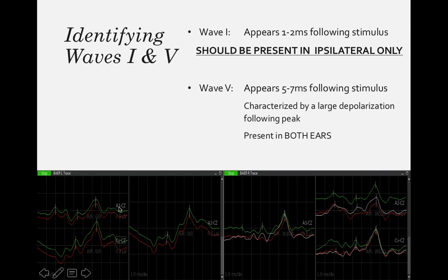So this would be our ipsilateral recording from our A1 electrode, our ipsilateral recording from our cervical channel, and then our contralateral recording from the other ear. And we have that split in both ways. Sometimes you'll see all 3 of these along the same grid. I like to separate them out. I think it's easier for me to remember which one is the contralateral side when I have them divided horizontally. But it doesn't have to look like this. I just prefer it to look like this.